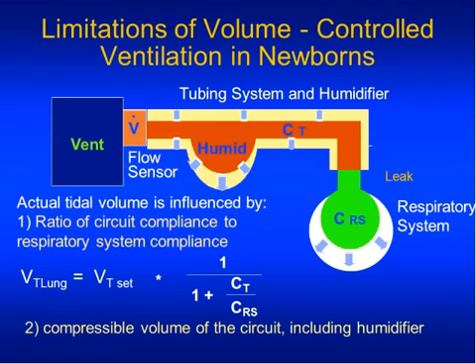So great. Well, we have ventilators that can deliver controlled tidal volume, right? We have volume controlled ventilators. We use them all the time in the adult and pediatric ICUs. Why not just take one of these machines and put it on a baby?